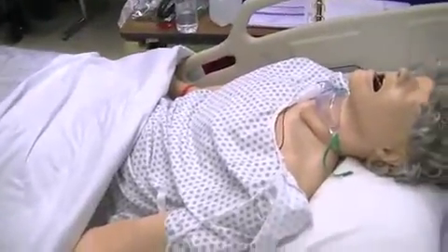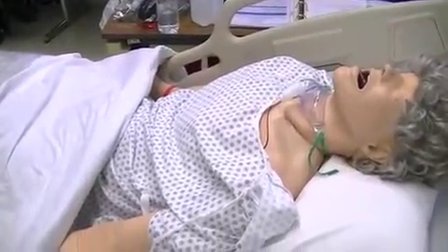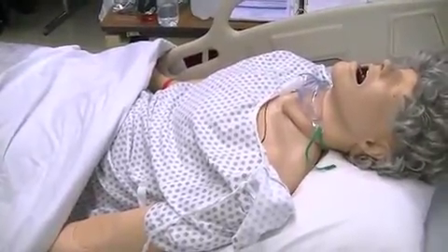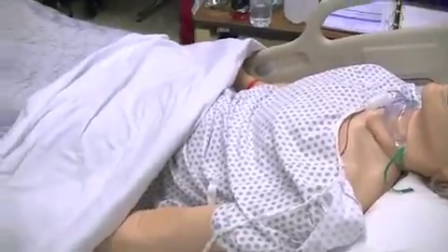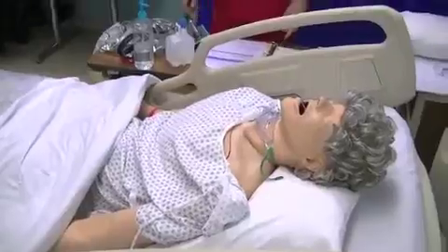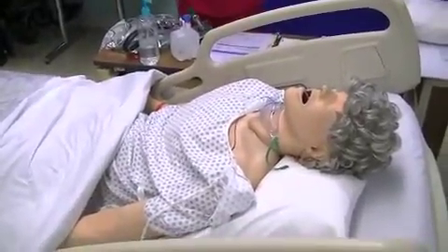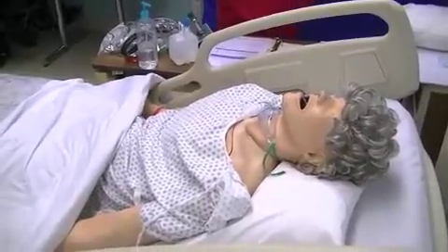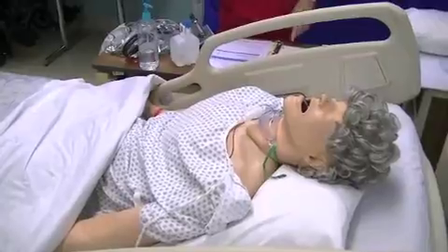Mr. Pierce, do you know what oxygen is for? Okay, you said it's to supplement your breathing, because room air is considered 21% oxygen, so we want to make sure. Room air is 21% oxygen, so that's what this is to supplement, because you're not getting good oxygen saturation as we would hope to, so we're going to put this device on you.